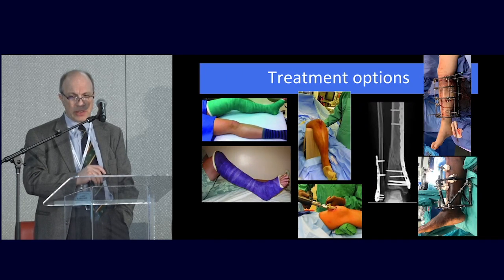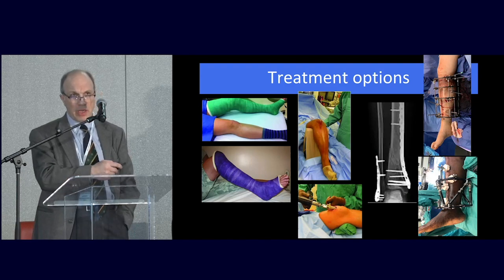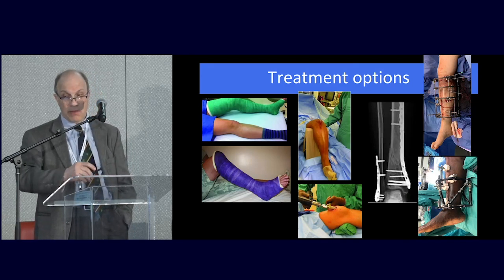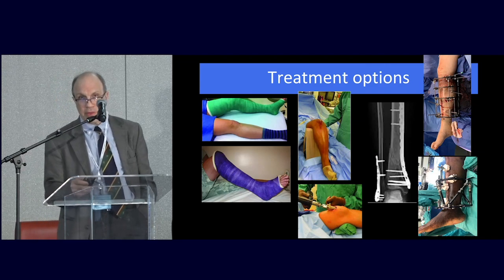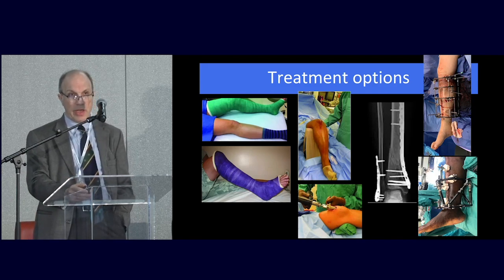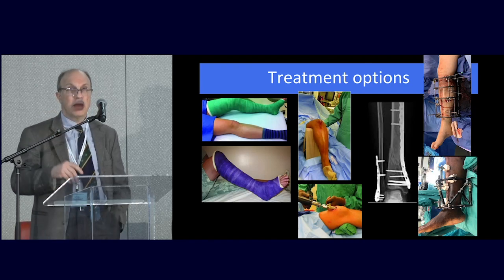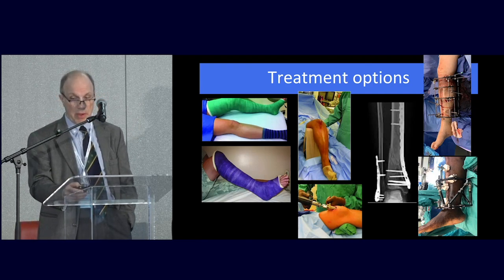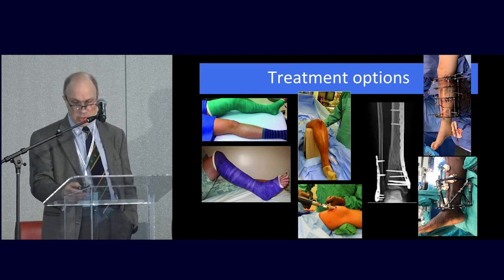Overall, for tibia fractures, there are different treatment options. On one side, you can cast them if they are minimally displaced. On the other hand, if there are really bad soft tissue injuries, or you really want to do some kind of circular fixation, you can do that. You can do plating in the metadiaphyseal segments, and basically bypass the whole segmental fracture line with a plate. That's possible too. But most commonly, you're going to see some kind of intramedullary nailing.